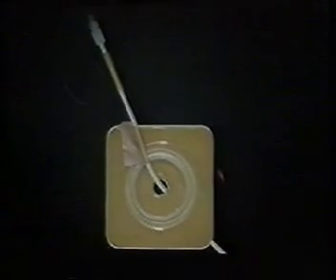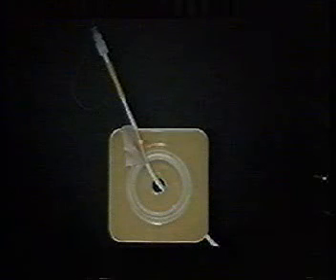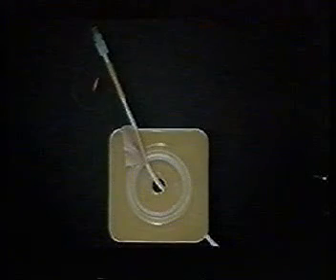Here's an example of the fixation device that we use at the University and County Hospital. This is a regular old Stomahesive device which is placed over the catheter onto the patient. We then sew through the tape around the catheter and through the ring of the Stomahesive so that in fact the catheter is really not sewn to the patient but is really sewn to the Stomahesive device itself. This catheter, in this case a Cope nephrostomy catheter, is attached then to a Pleurovac suction device which is placed by the patient's bedside and put to underwater suction, usually at minus 20 centimeters of water.